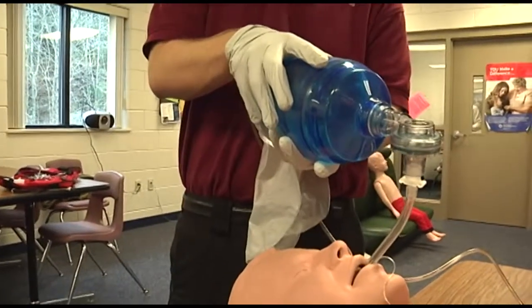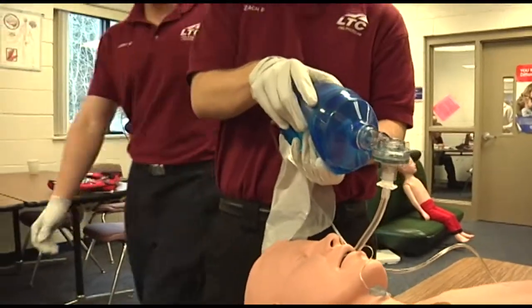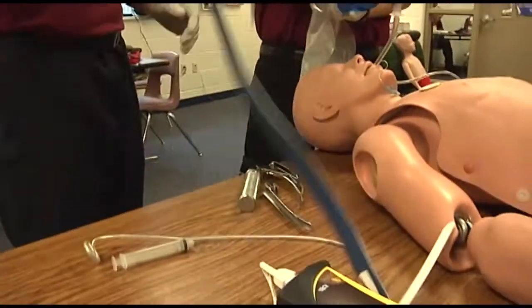Secure the ET tube with tape or a commercial device. A C-collar may also be placed at this time.